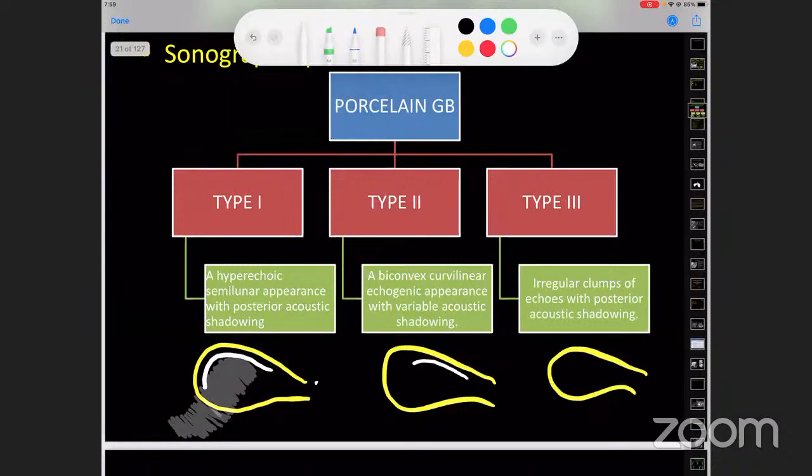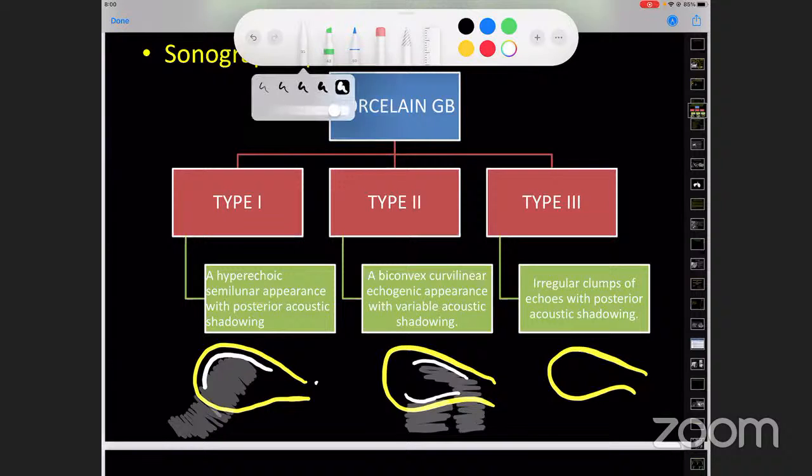You draw part of that anterior wall, but that's it, and part of the posterior wall. So you can now see two walls. Right. And then what will be the shadow like? You'll see a part of the shadow out here, and part of the shadow out there. So it will be part shadow, biconvex. Biconvex, okay.